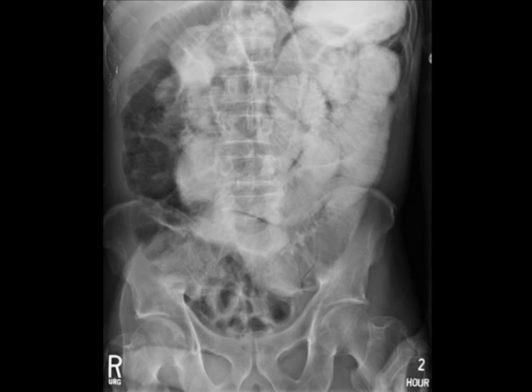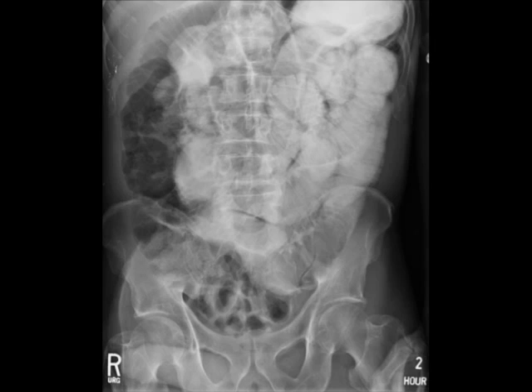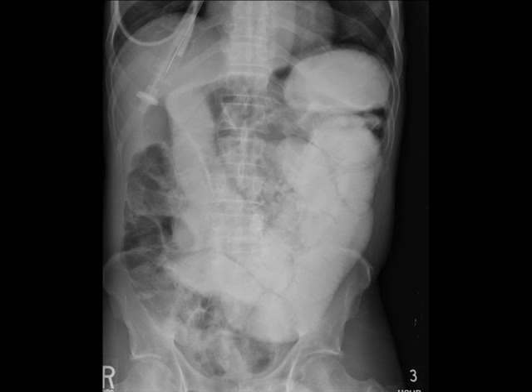Once taken, the radiologist is called and asked to review the images and give instructions for the next steps to be taken. Depending on the pace of the contrast movement, the radiologist will decide how much longer before he wants another image to be taken. In this case, the radiologist requests another image at the 3-hour mark. After the 3-hour image, many more images were taken, lasting up to 16 hours.